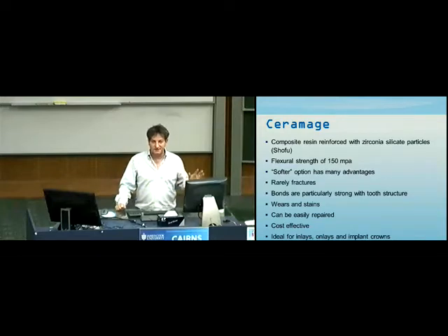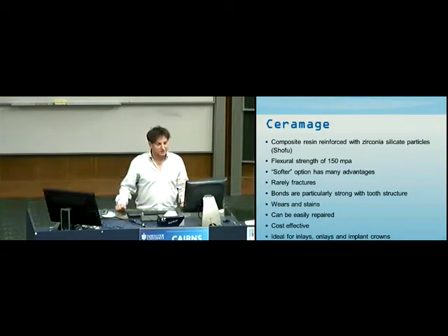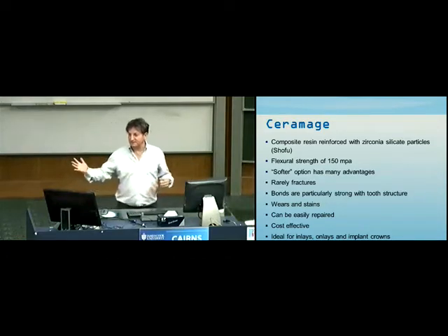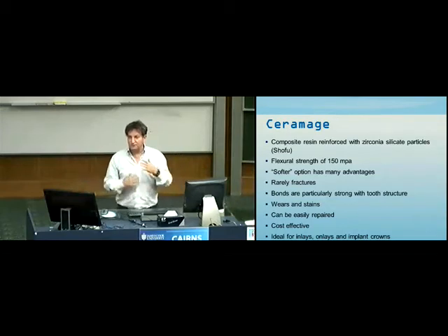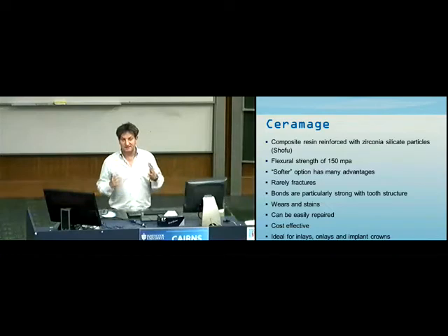But I can't tell you how many times I put VMK crowns in, and patients would come back a year later and say, gee, Dave, that crown you put on my upper left premolar was really good. But I'd broken the one below. That had an MOD amalgam in it, and a cusp had come off. Bob, I don't know if you remember seeing the same type of thing, but we didn't really understand what was going on. The big problem was the hardness of that ceramic was causing a lot of damage.